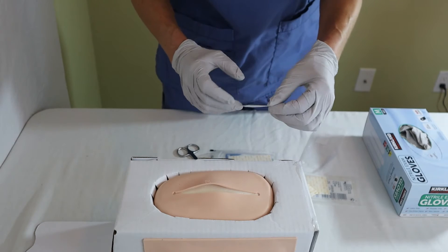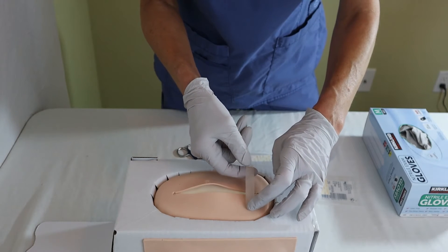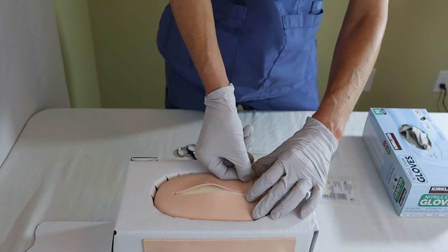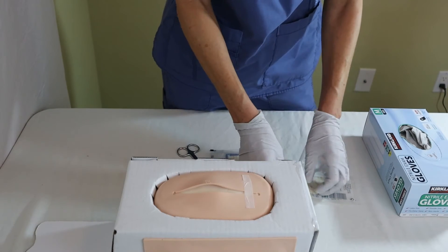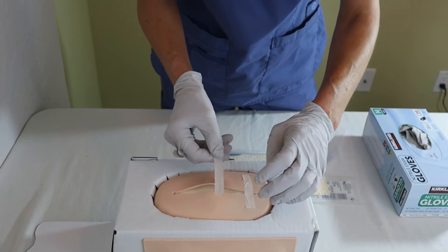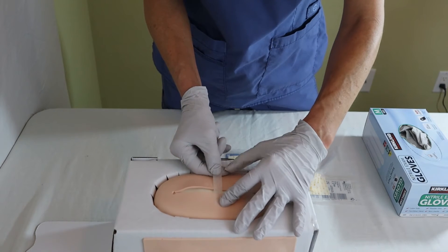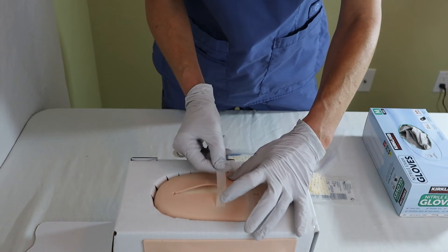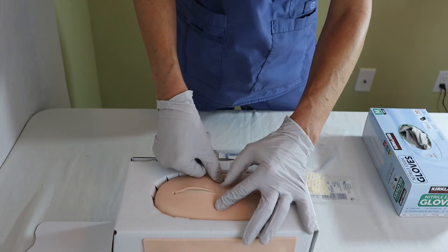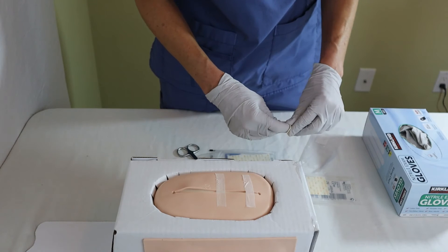The other key is that you want to secure the SteriStrip on one end and then pull it over to help close the wound. In this case, since we have a big opening here, I will put one right across — tape this down and then hold it closed. You can see I can really hold these wound edges together.